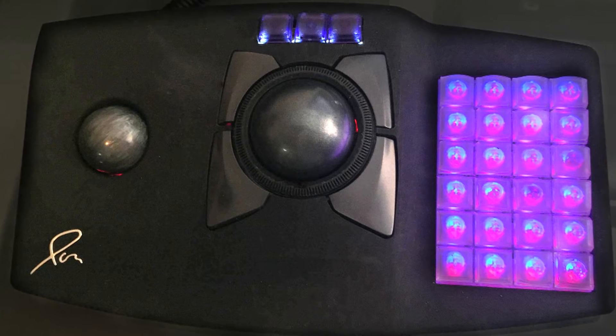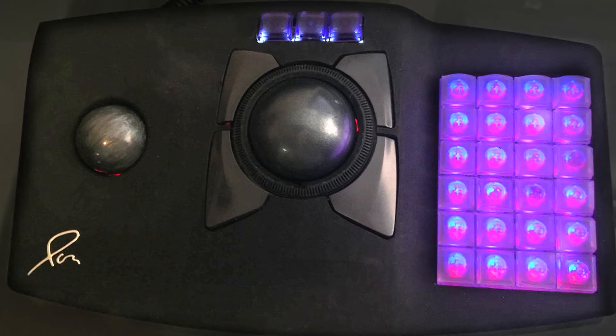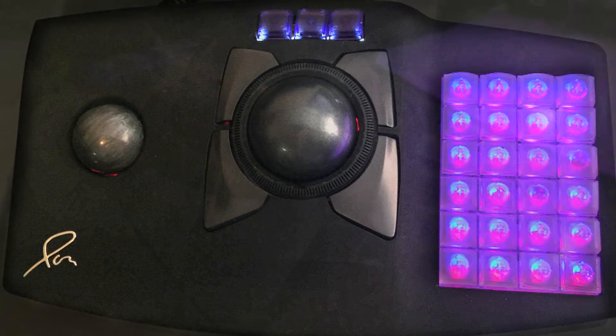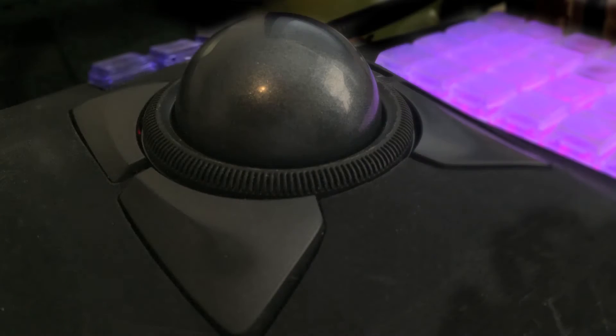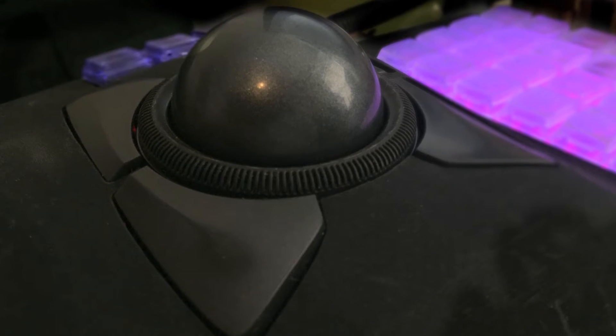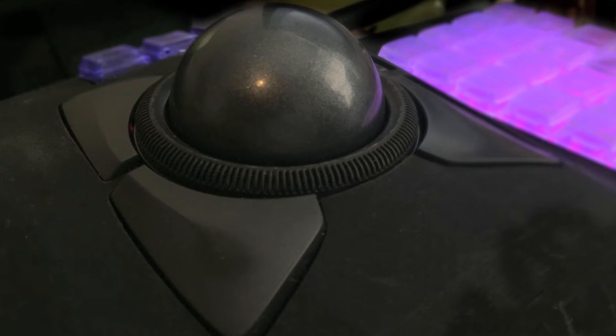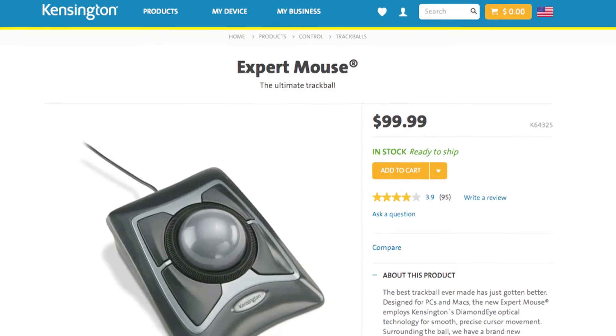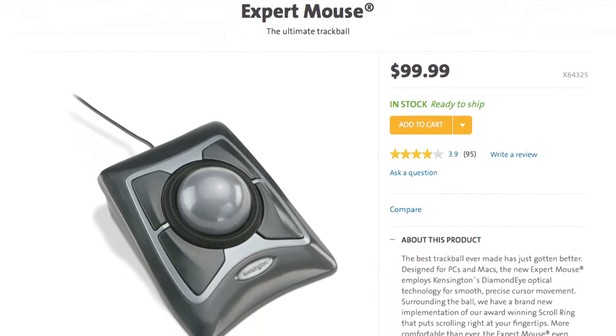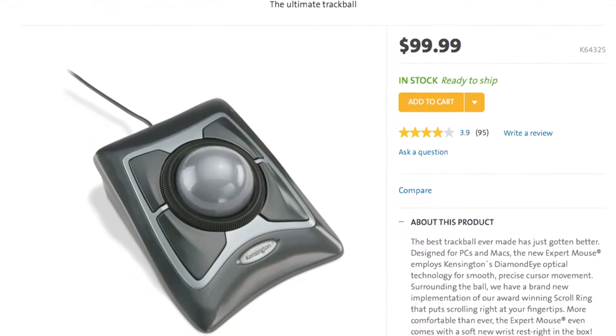Many of the things that I've shown are not that difficult to set up. For my primary trackball, I use a Kensington Expert Mouse trackball. I don't use the driver software that comes included.